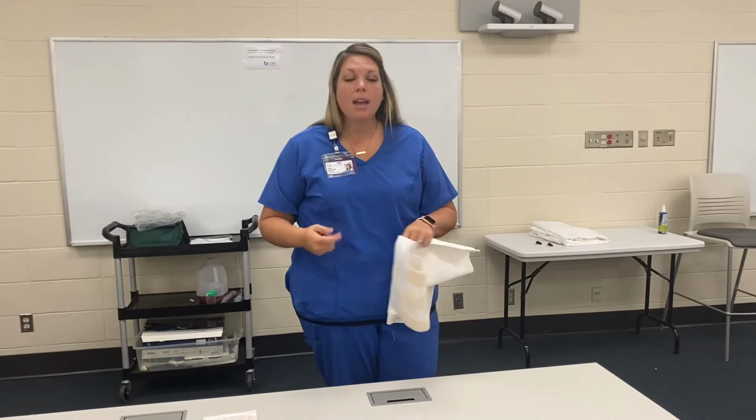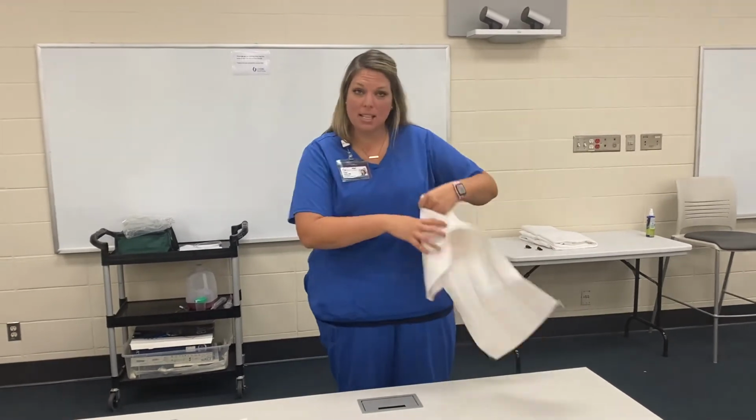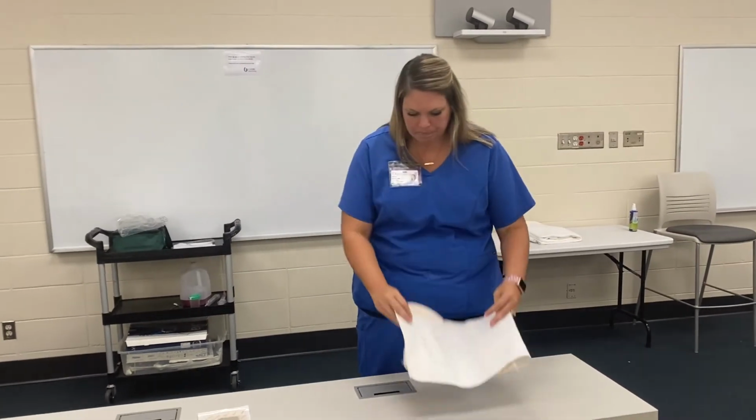We talked about restraints in our safety lecture. Sometimes we'll get these if we have a patient that has a PEG tube in their belly and they're confused or disoriented and they keep trying to pull it out. We'll loosely place one around the patient's abdomen to cover that PEG tube. Of course, we're not going to obstruct it or cause any issues with the PEG tube, but it acts as a cover, and that would be, at least, an alternative to a restraint. So we get creative sometimes. So that's an abdominal binder.